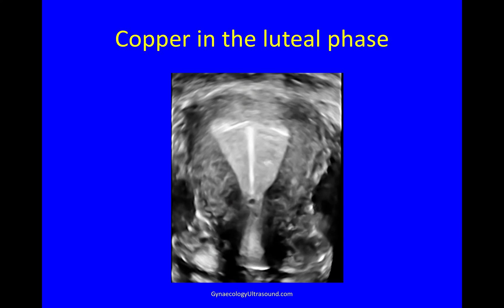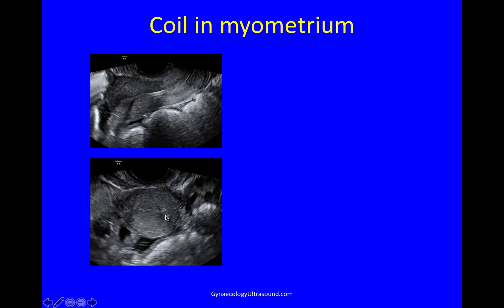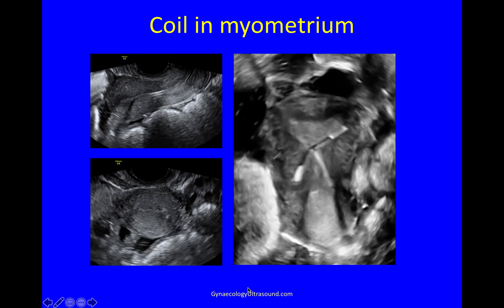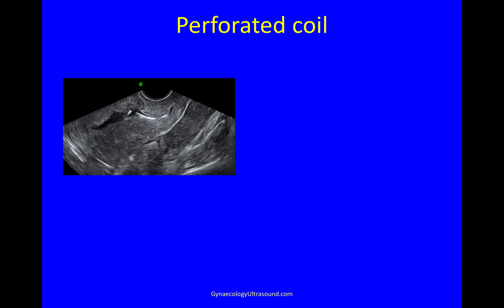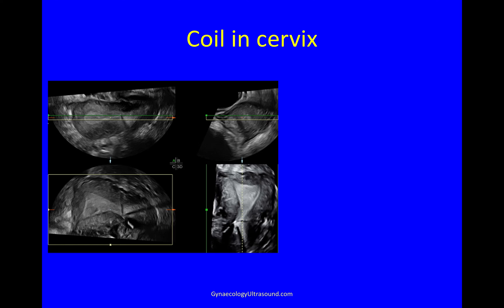Coils show up beautifully on 3D ultrasound. Here is a copper coil in the luteal phase endometrium with a normal-shaped cavity, but on 2D the coil position was hard to determine — you can see a shadow and a suggestion of coil on 2D transverse. On 3D it is instantly obvious: one arm of the coil has perforated the myometrium. In another case it was not at all clear on 2D, but on 3D it was obvious — the coil had been inserted through the posterior uterine wall. In another case the coil is in the cervix.